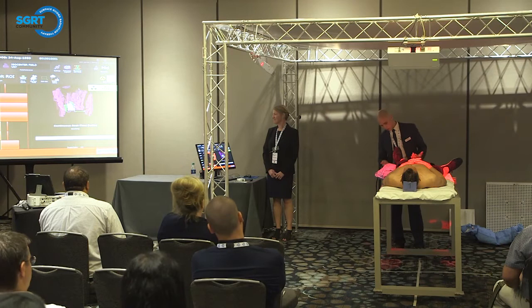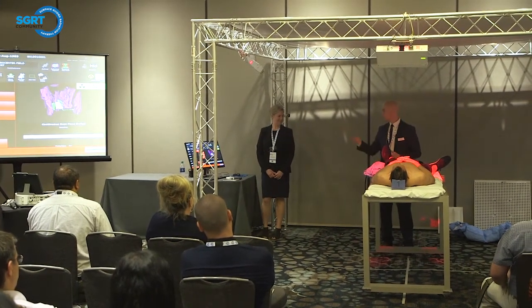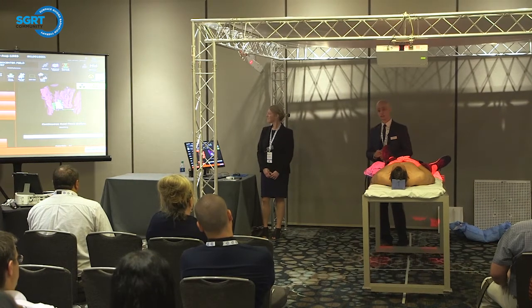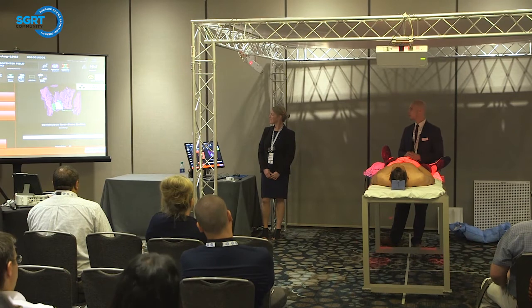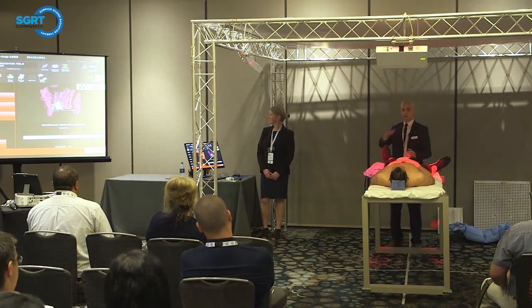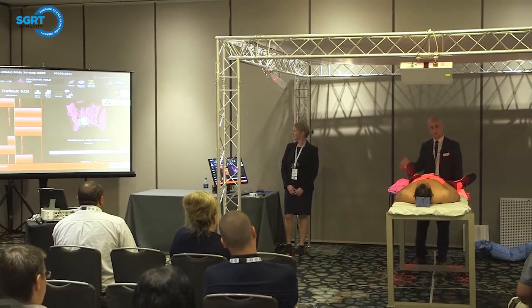I can tell right now by looking at him that he's not in the vac lock the way that he's supposed to be. So that's a good indicator using the system that he really isn't in the immobilization device the way he should be. So that's a good start. I'll probably start with the pitch. Then I'm going to move the rotation or the yaw, which is just left to right. Okay, we have the pitch and then the roll. In the roll, I'm just going to take his foot and physically move it left to right.